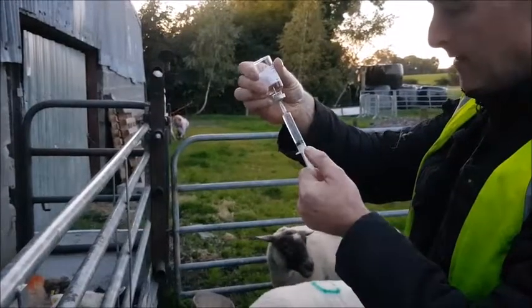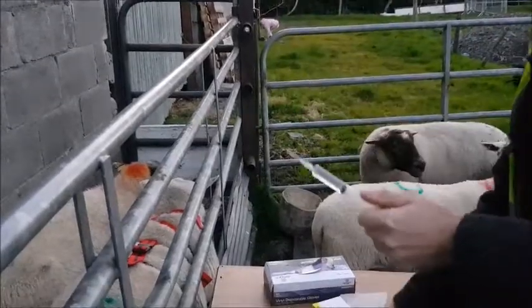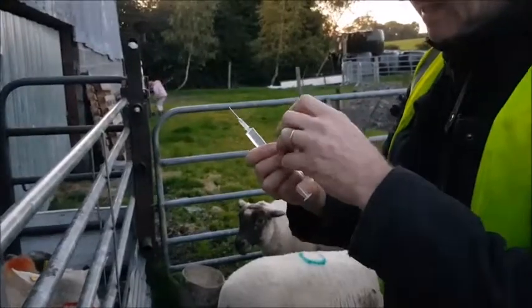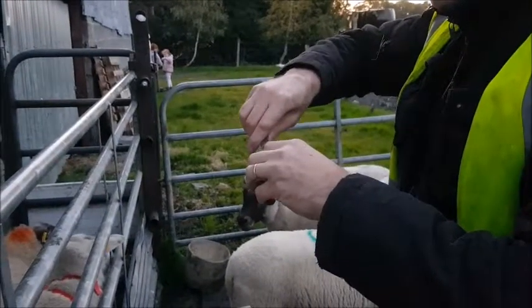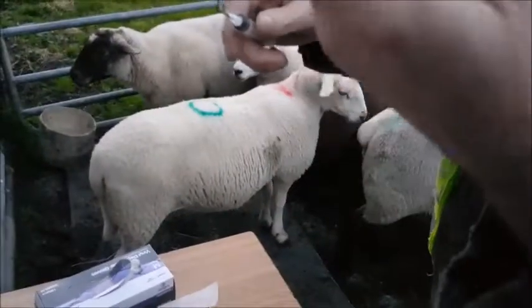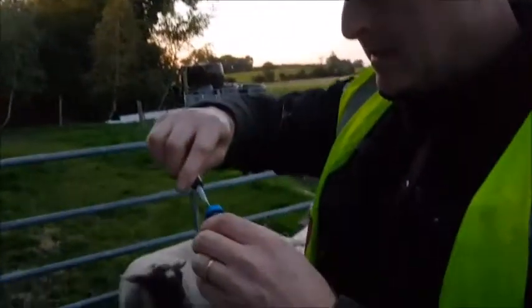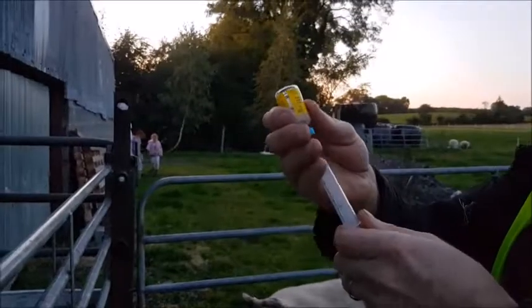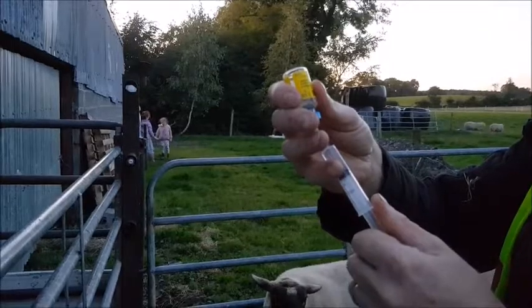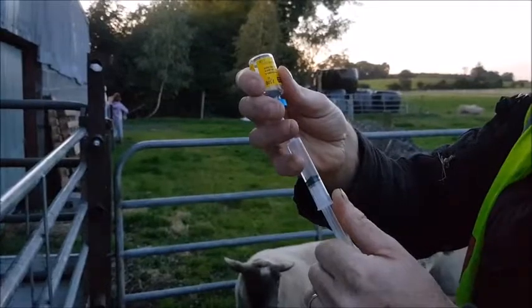Day 12 for these sheep. We are using the Stimovar — this is the diluting. We have to put 5ml into the frozen powder to activate it, leave it for 1-2 minutes, and then put it back into the dilutant. All being equal it will probably be at least 5, maybe 6ml.